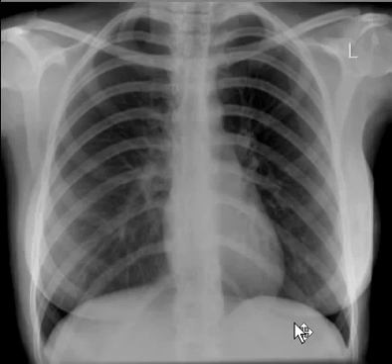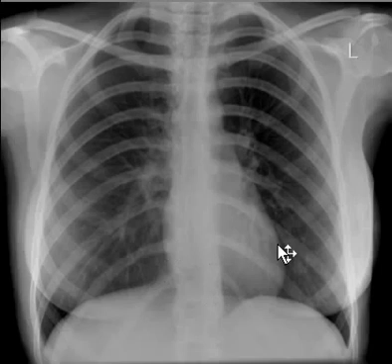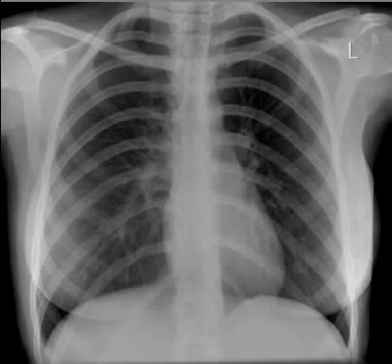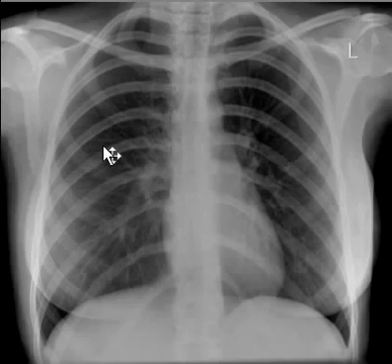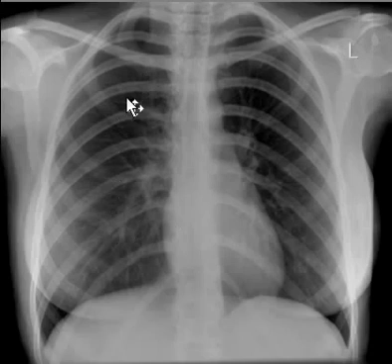Lung parenchyma is visible in the retrocardiac area, suggesting that the left lower lobe is not collapsed. All other lobes are normal as well. The heart size is roughly less than half of the thoracic diameter, suggesting there is no cardiomegaly. Radiologists have electronic tools to measure the cardiothoracic ratio. Vessels are bigger near the hilum and get smaller towards the periphery. Lower lobe vessels are bigger in diameter compared to upper lobe vessels.